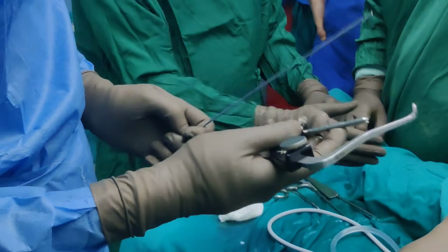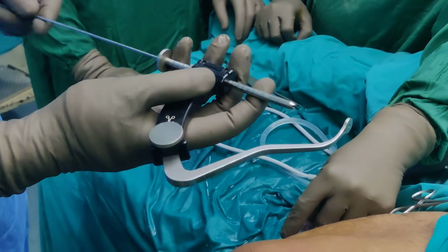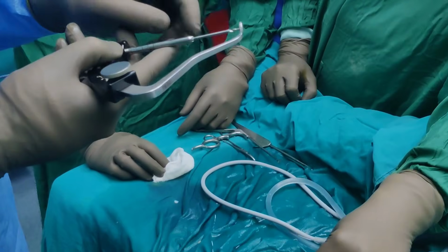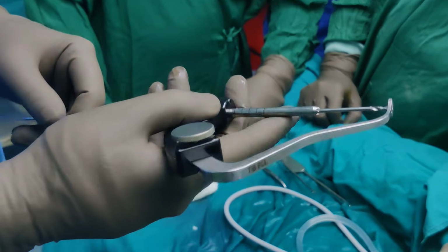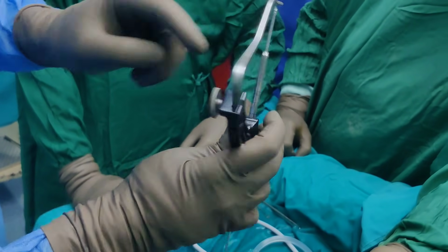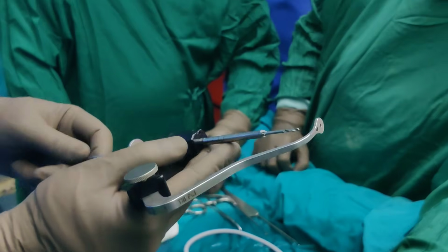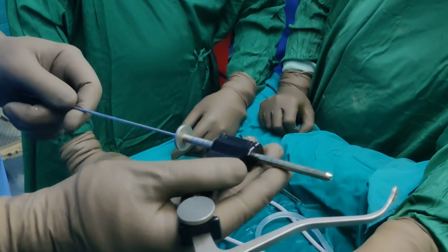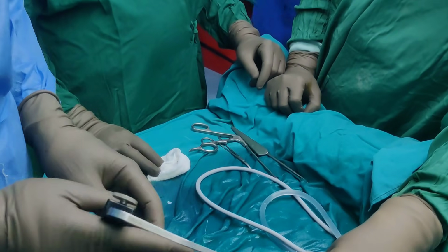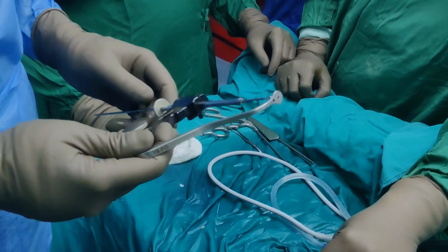Now this is the Arthrex jig that we are going to use today. One good thing about any jig is that it should be closed, so that there is no option of it going out the back and damaging anything. Also, this is curved, deliberately curved in order to avoid the ACL, so that you have good access. The next step will be to pass this jig from the medial portal and drill our medial transtibial tunnel, so that the graft can pass through the tibia.